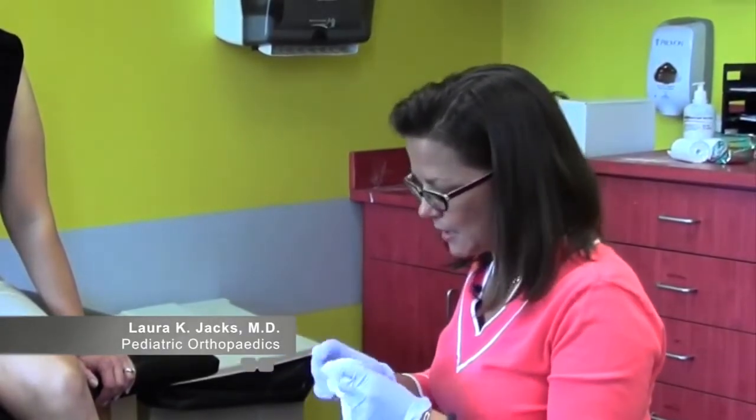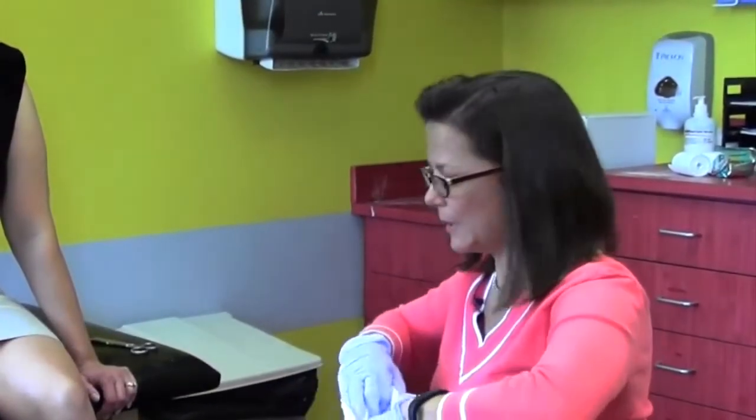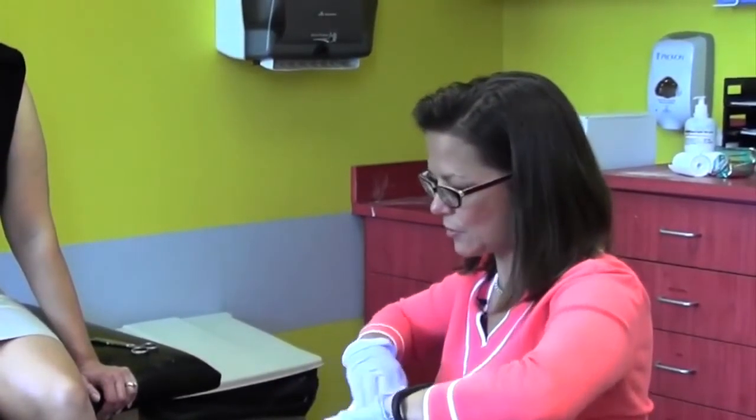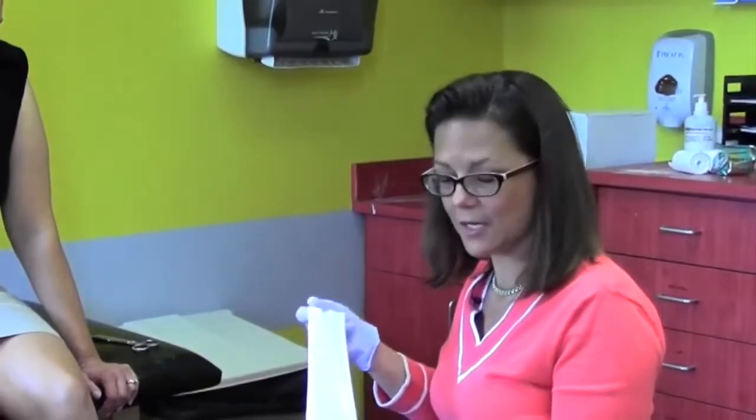So now we're going to discuss how to place a short leg cast. This can be done in an emergency department setting, not if you're anticipating a great amount of swelling, but I think everyone should know how to put on a short leg cast, whether it's in an office or an emergency department setting.